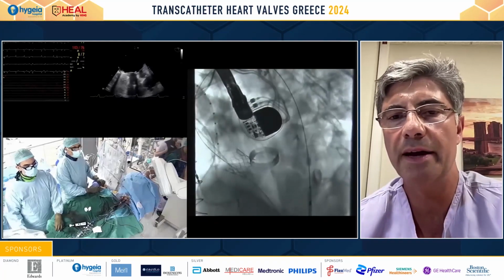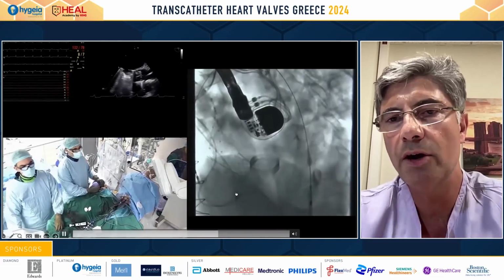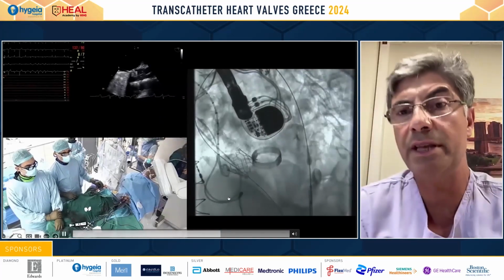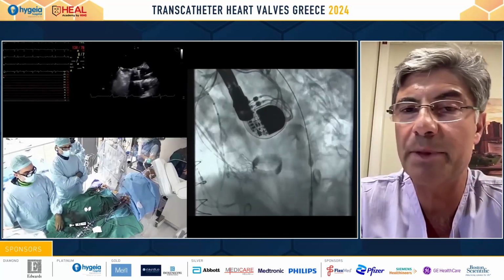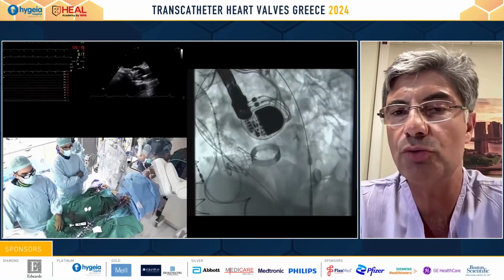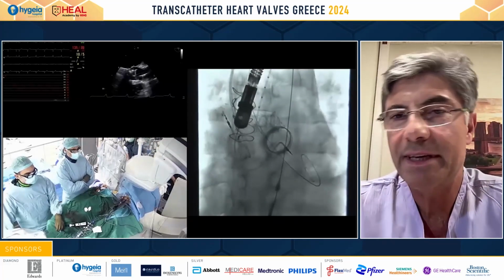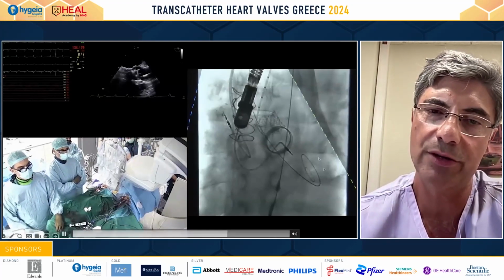You can see from the cranial view as well, there is some small overlap fluoroscopically, but we don't see it in the TOE. So of course, maybe the TOE has a point. We'll have to check it from many aspects. But fluoroscopy is 2D imaging, so we need to rely on TOE as well in this kind of situation.